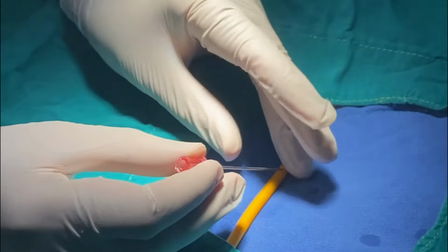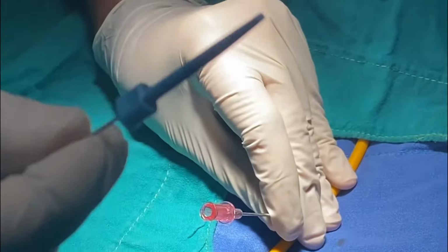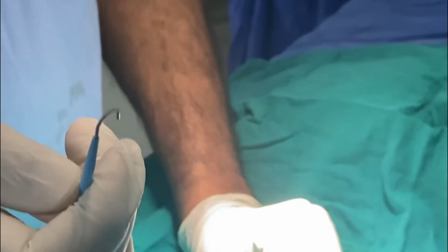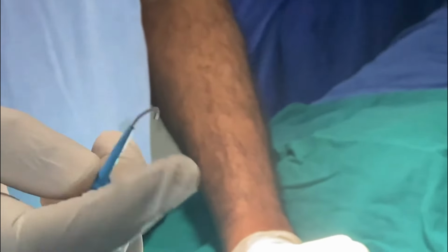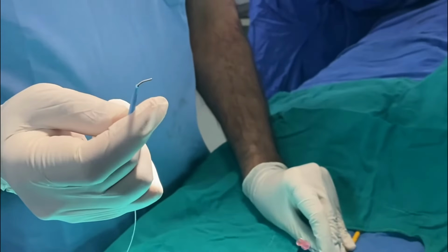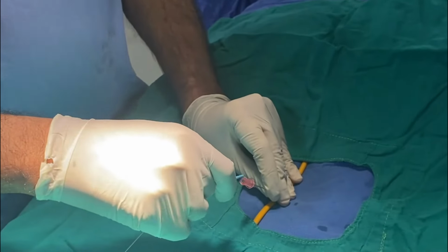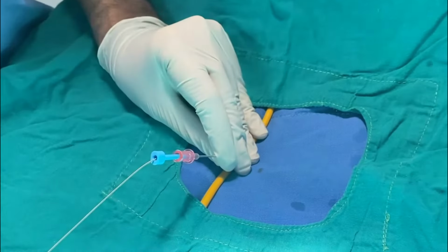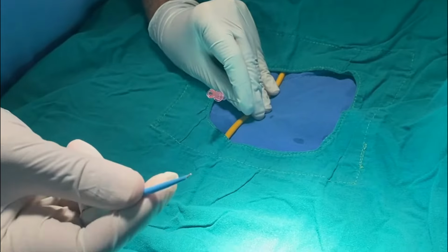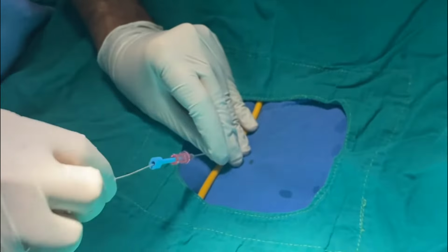Once it punctures, with these two fingers stabilize the needle and very carefully insert this. What is this? This is the J-tip wire. The J-tip wire means the tip is always curved like this. The idea of a J-tip wire is that it is atraumatic. The moment it comes out of this, it will become a J. It will not traumatize the blood vessel. So you have to use this introducer to introduce it, otherwise it will be like this and difficult to introduce. Put it like this, introduce it like this, and very slowly push.